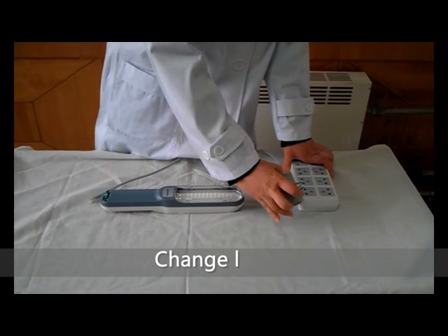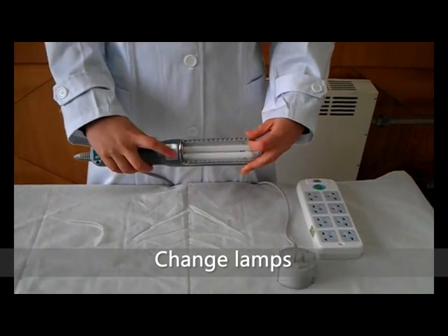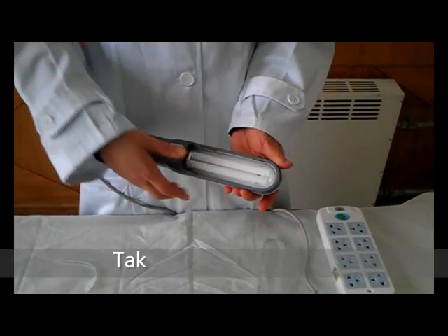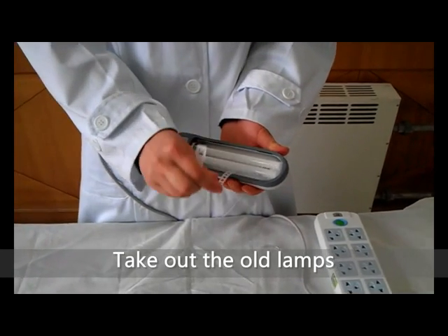Finally, we introduce the replacement of lamps. Before replacement, please cut off the power. The replacement lamps must be the same model. Lamps are fragile items; please handle with care during assembling and disassembling.